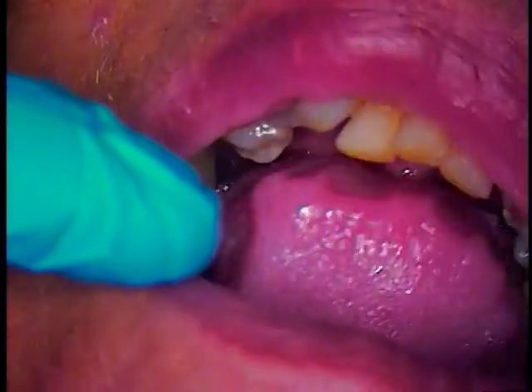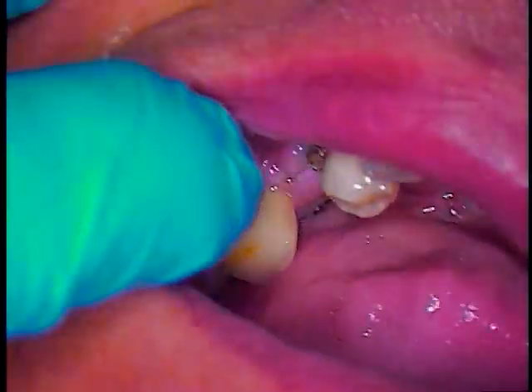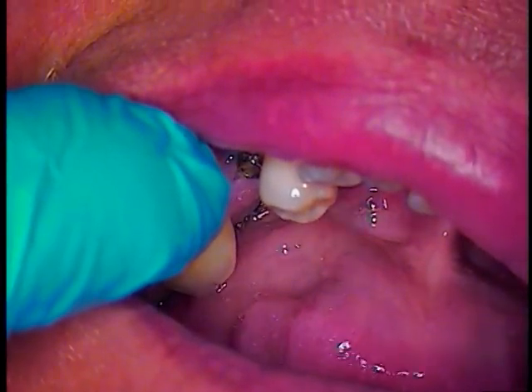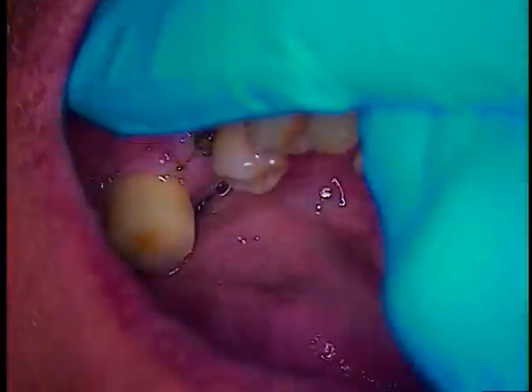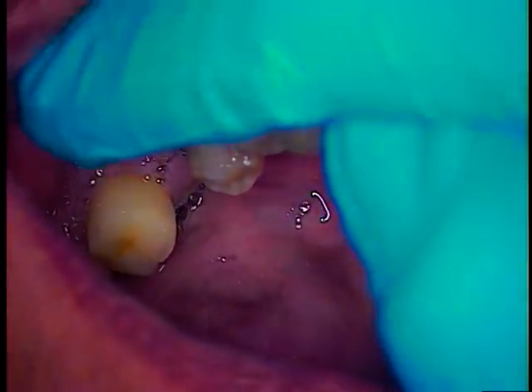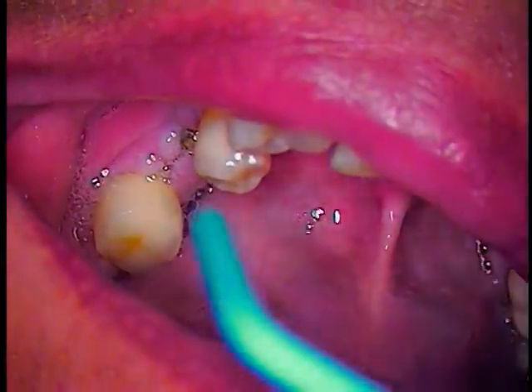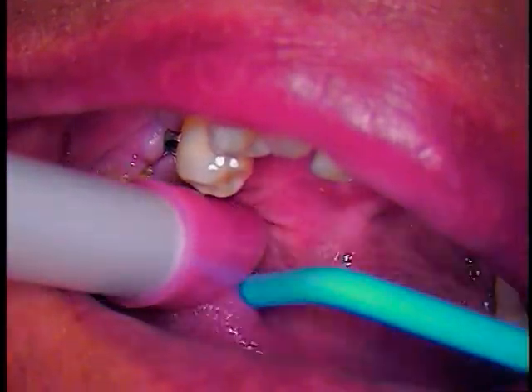We're going to look inside now. The periodontist did make access and was able to expose the portion in the mouth. There was prior access and prior attempts to remove a tissue extension, which was incorporated with the case. We're going to use just a little bit of air here and get out some of the food particles that are in there.